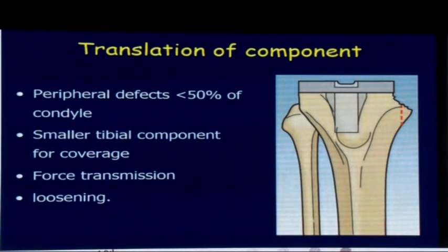You invariably land up with a smaller tibial component, so you need to be aware what sort of mismatch the system that you're going to use allows. Because if you already have a mismatch between the component sizes before you decide to translate, you can't really do that. For example, the PFC system and the next-gen system, it allows 1 up, 1 down, and if you land up with a 2 up, it's incompatible. And that compatibility as a surgeon, I think you should be aware of.